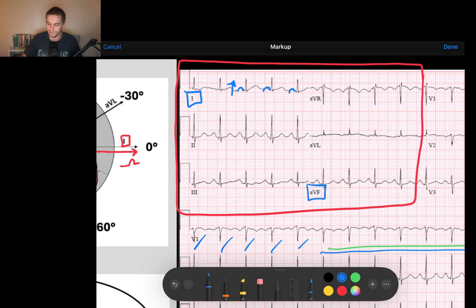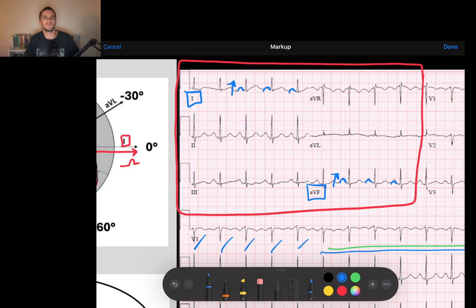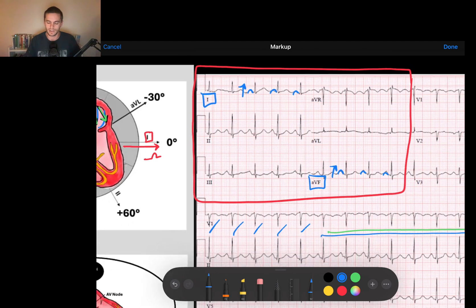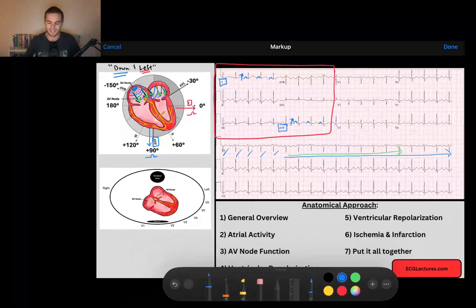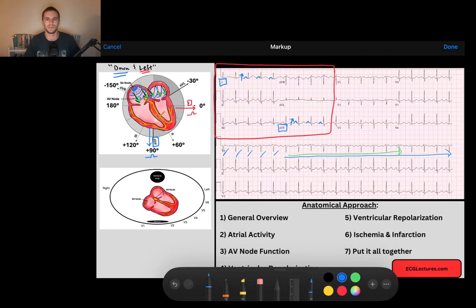And AVF, upright, upright, upright. So that tells me that those P waves are heading down to the left, and that this is a sinus rhythm.